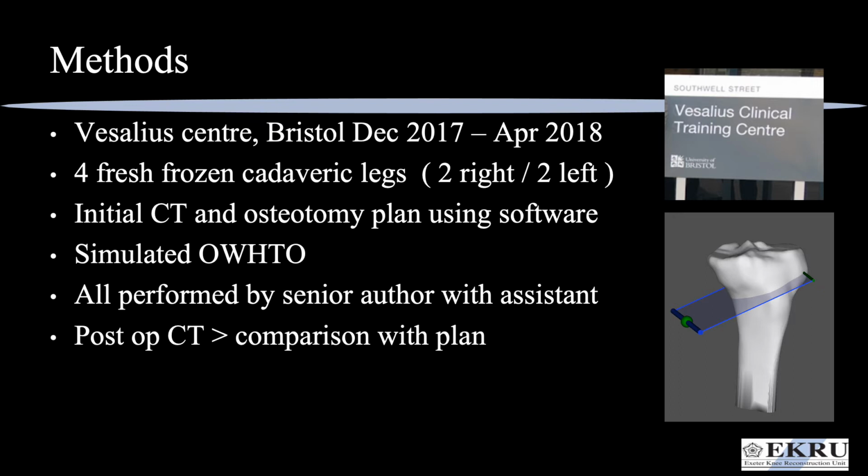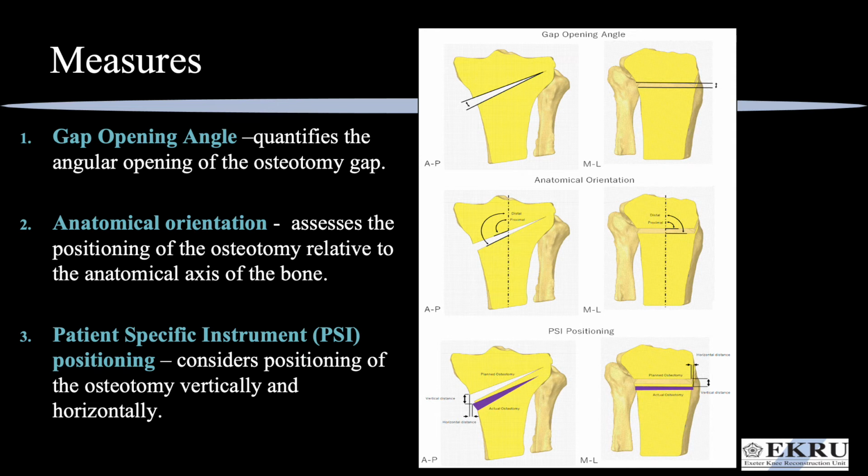The procedures were performed by the senior author from Exeter knee team with a surgical assistant. Then postoperatively, a further CT scan allowed 3D assessment of the correction achieved for comparison with the preoperative plan. 3D assessment allowed evaluation of 3 variables.